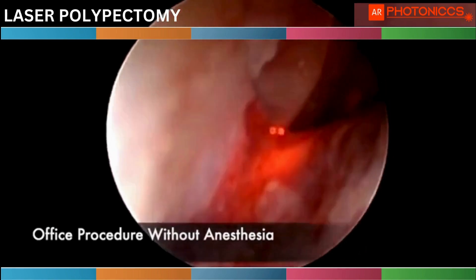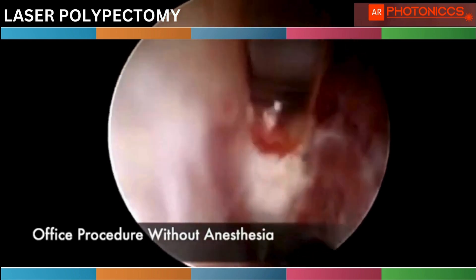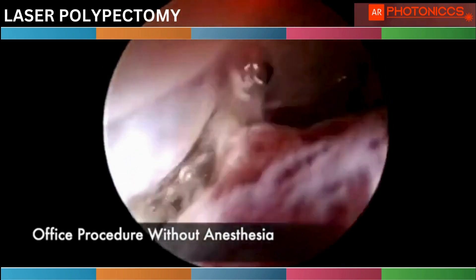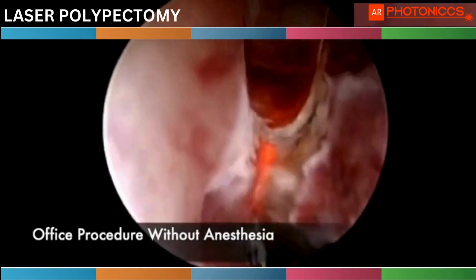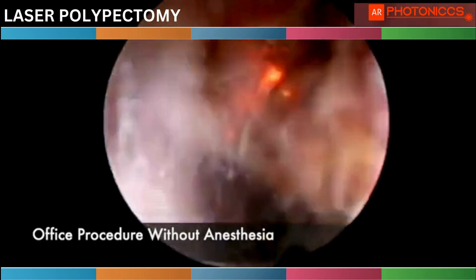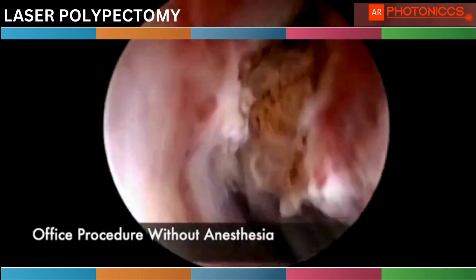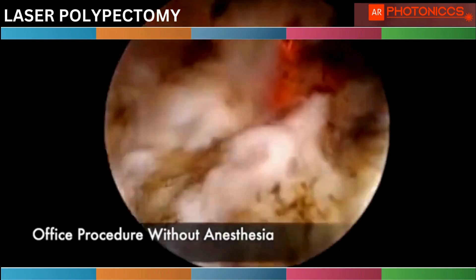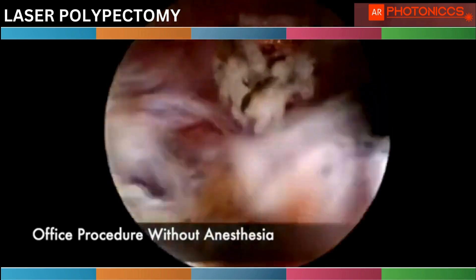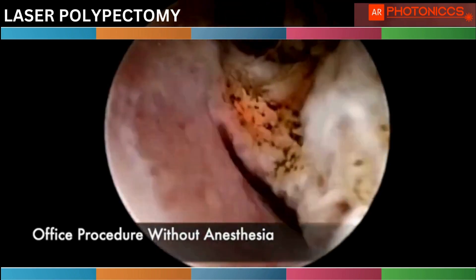Now you can see a polyp case — how precisely at the implantation site we are cutting, without a drop of blood. The vision is clarity: you can see exactly where you are cutting and where you are coagulating. If you do this with a resectoscope 26 French, it is very difficult to cut that plane with bending or inclination. This is only possible with laser silica fiber by diode laser in hysteroscope.